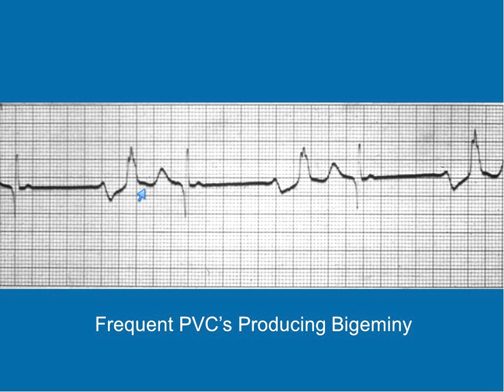This is not a healthy heart. So normal is relative. But the reason I'm calling this normal and this the premature contraction is because there's a compensatory pause, and you have another normal beat and then another premature beat. But like I said, the normal beat has a bundle branch block in it. It's not transmitting the impulse like it should.